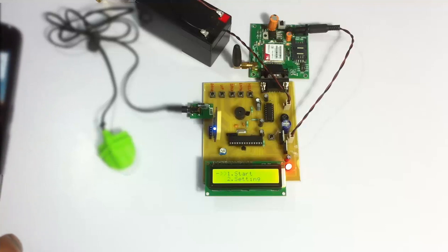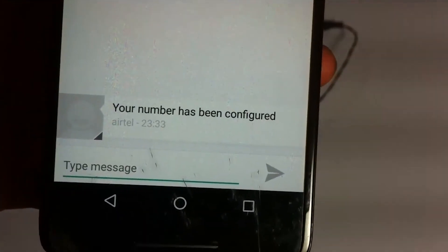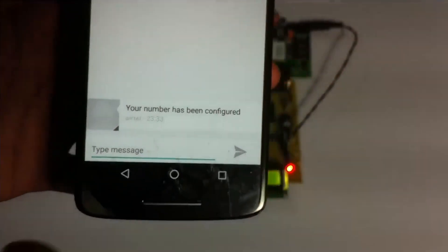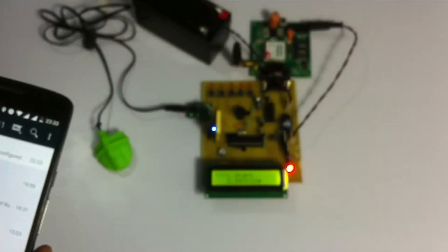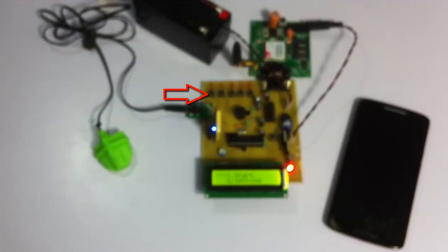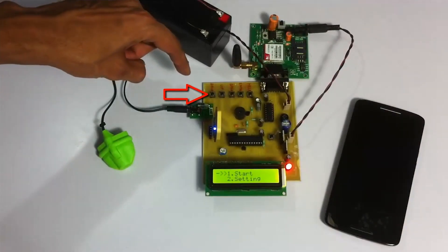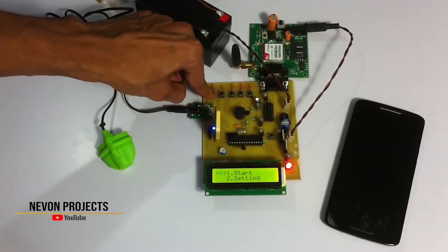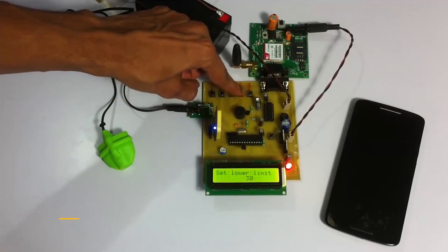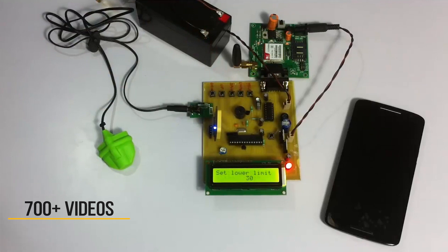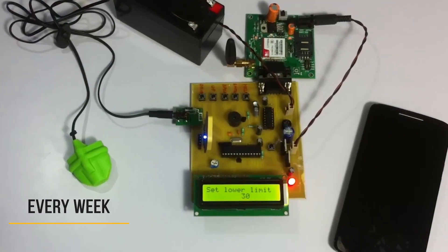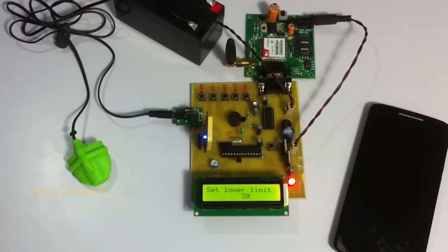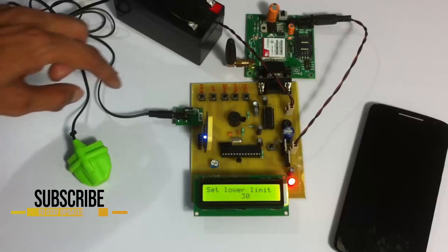We can first check out the setting mode here. This is the message that is sent when we register to the system successfully. Now we can go into setting mode using these push buttons here. Now we can set the lower and upper heartbeat limit. If the soldier's heartbeat exceeds or falls below this particular limit, it's going to send this in the SMS message.